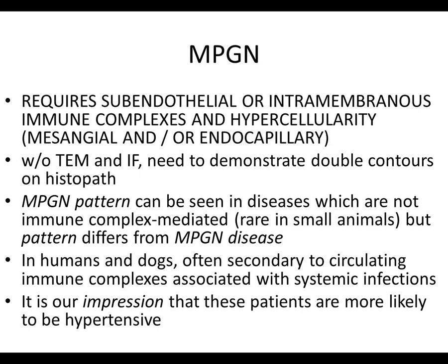So I'm very upfront with the clinicians that submit the biopsy by saying, look, it has a pattern, but I need the additional studies before I can definitively call it. And I think there's nothing wrong with you doing that, especially if you're out in practice and reading for IDEXX and you have an impression of what it is, but you don't want to expose the dog to potentially very expensive and sometimes dangerous immunosuppressive therapy. That's why we're trying to be more straightforward about whether we do know it or we don't know it.